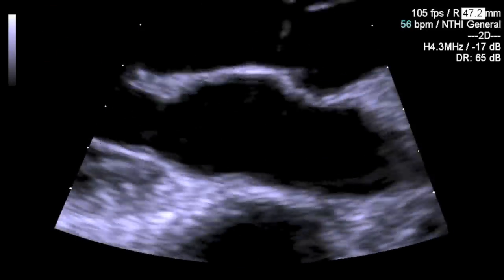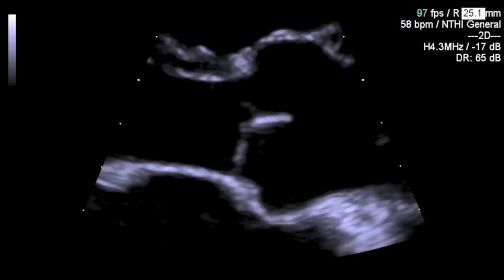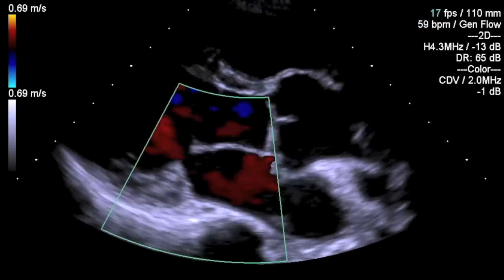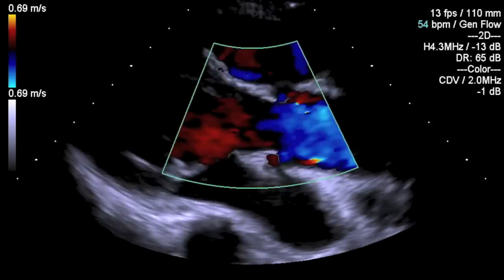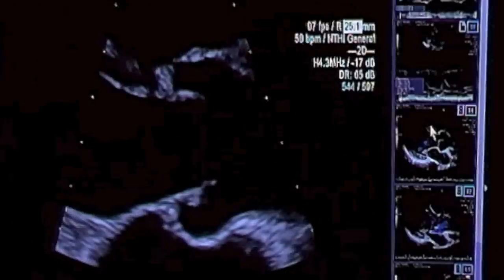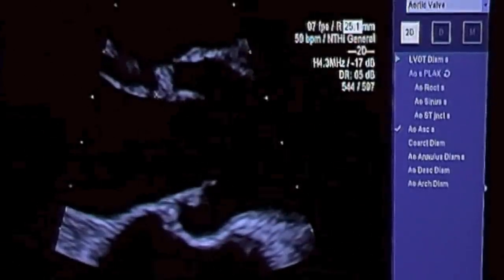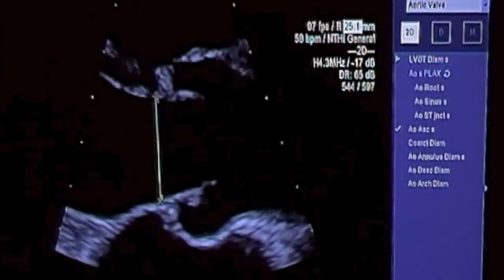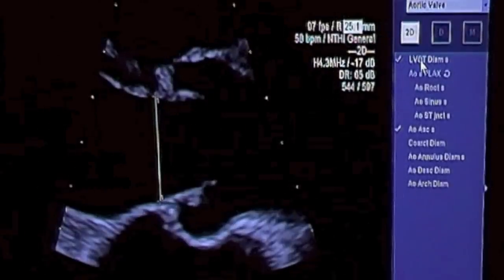Make an assessment of the mitral valve and the aortic valve, looking at the morphology and leaflet movements, and apply colour flow Doppler to assess for any gross valvular regurgitation. When zooming in on the left ventricular outflow tract, make an assessment of the size by measuring at leaflet insertion or one centimetre proximal to leaflet insertion — the distance at its widest point, which is usually in early systole.